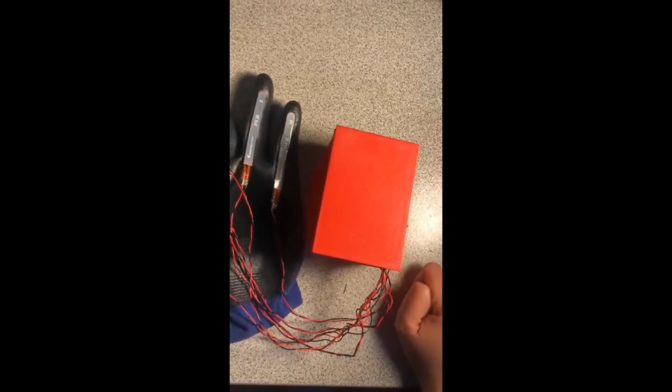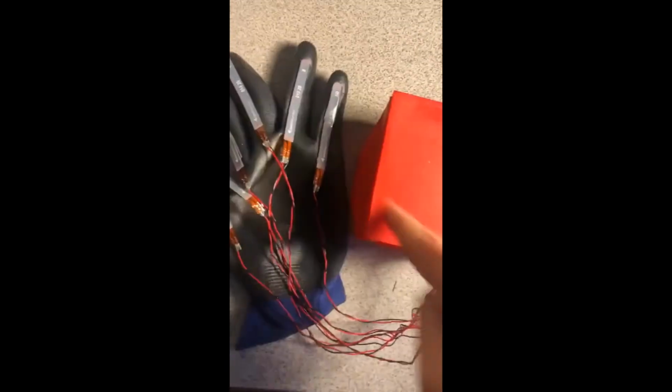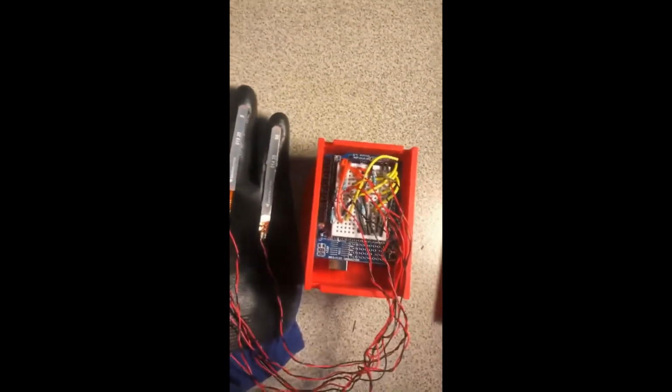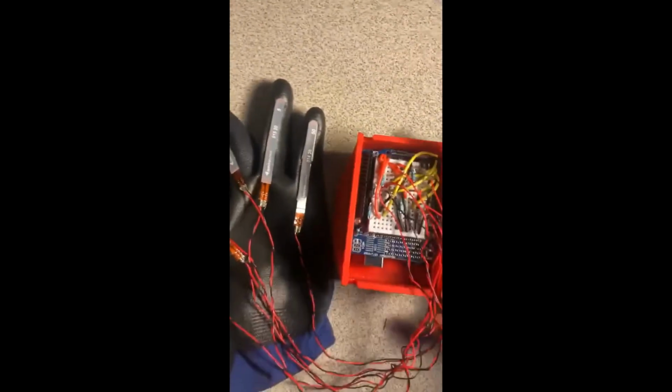The wire here is connected to the red box. The red box is a 3D printed housing. It has a cap on the top, which protects the circuit inside, and this cap can also be removed to update the circuit when needed. This circuit connects directly with the Arduino below it, which lets us read the data from the sensors and understand the trend of the motion.